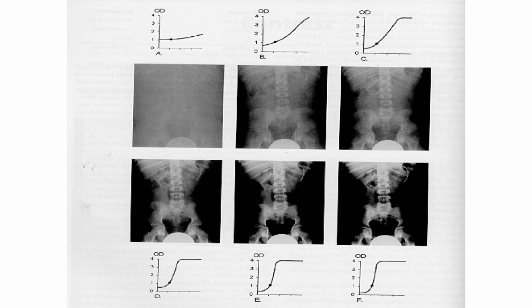Kaya nga, the best contrast depends of course to ano yung niro-roll out. Tama kanina yung sinabi ni Earl, na tinanong niya agad, ano pong niro-roll out? Okay. Kapag siya ay, let's say, scoliosis, kung scoliosis siya, makita na siya sa letter B saka letter C. Okay?